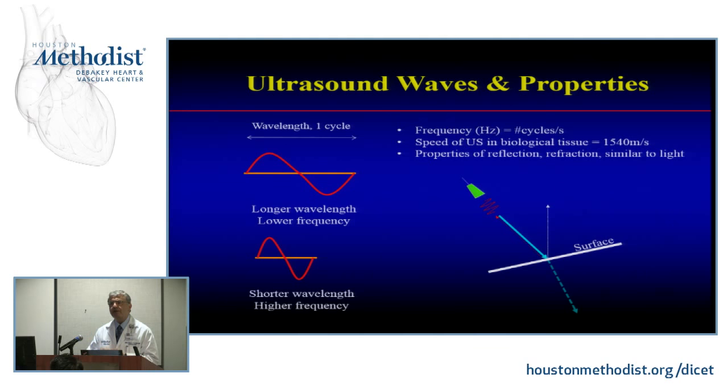So if I send sound all the time, like this, right? If you send it all the time, and it's reflecting from the walls, from the various structures, you have no idea where it's coming from, number one, and how deep things are. So in ultrasound, part of the principle is you send a packet, all right?